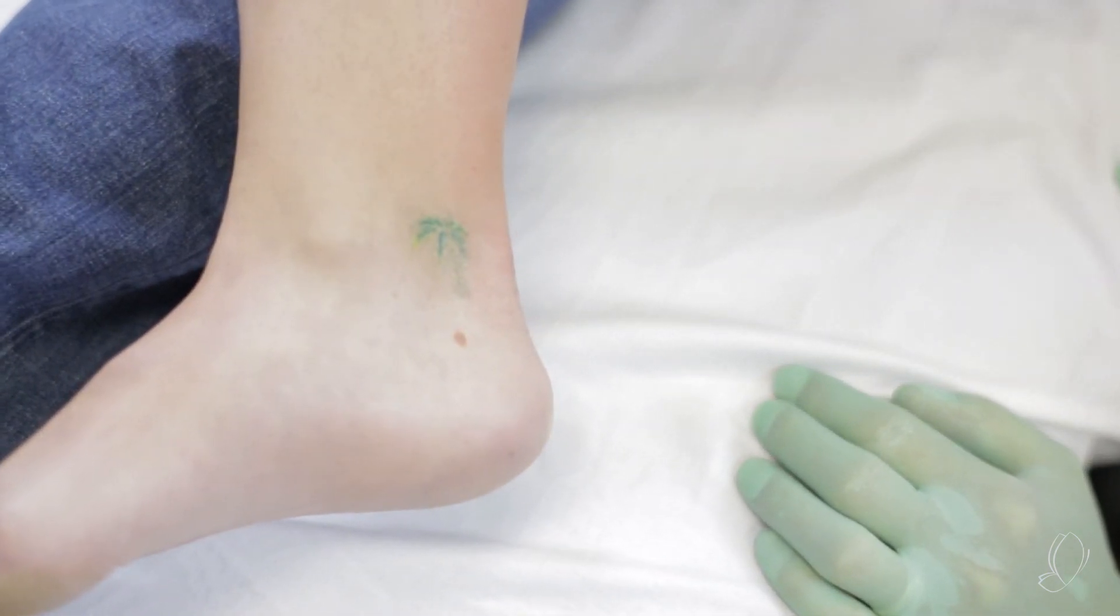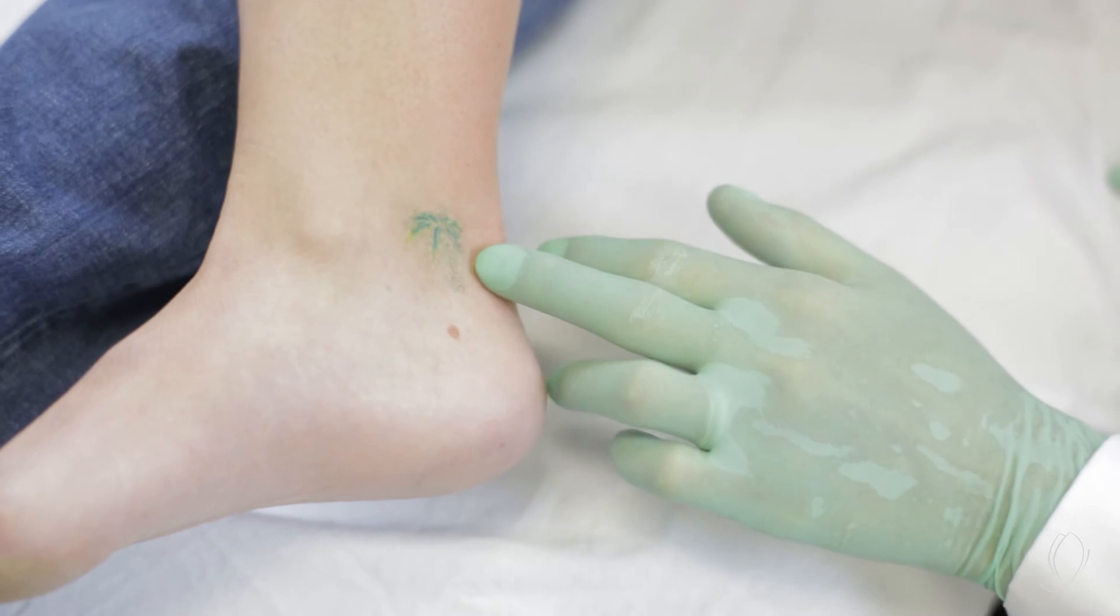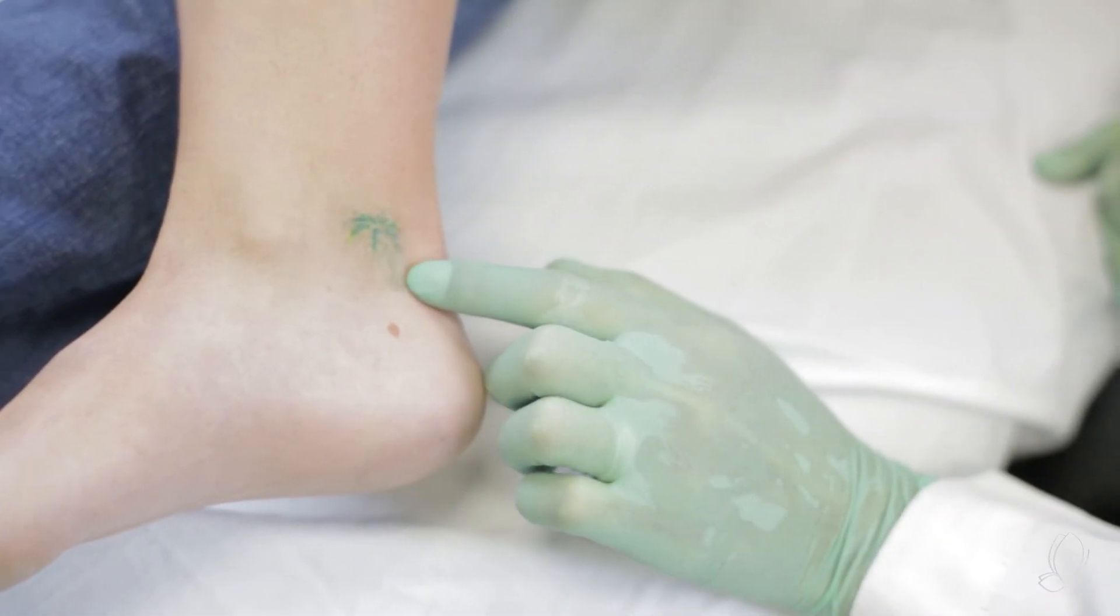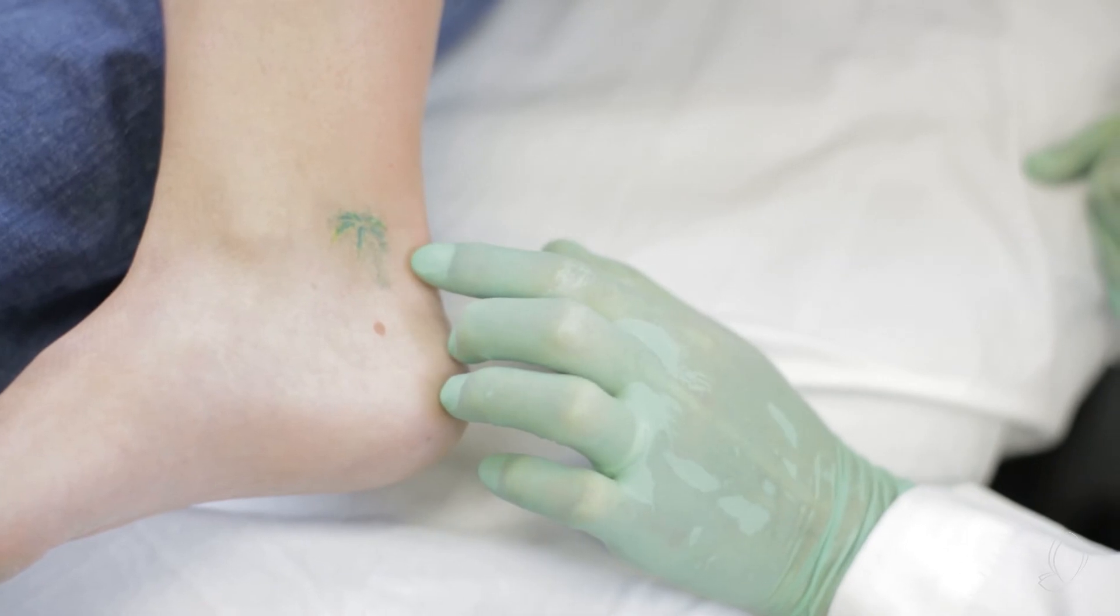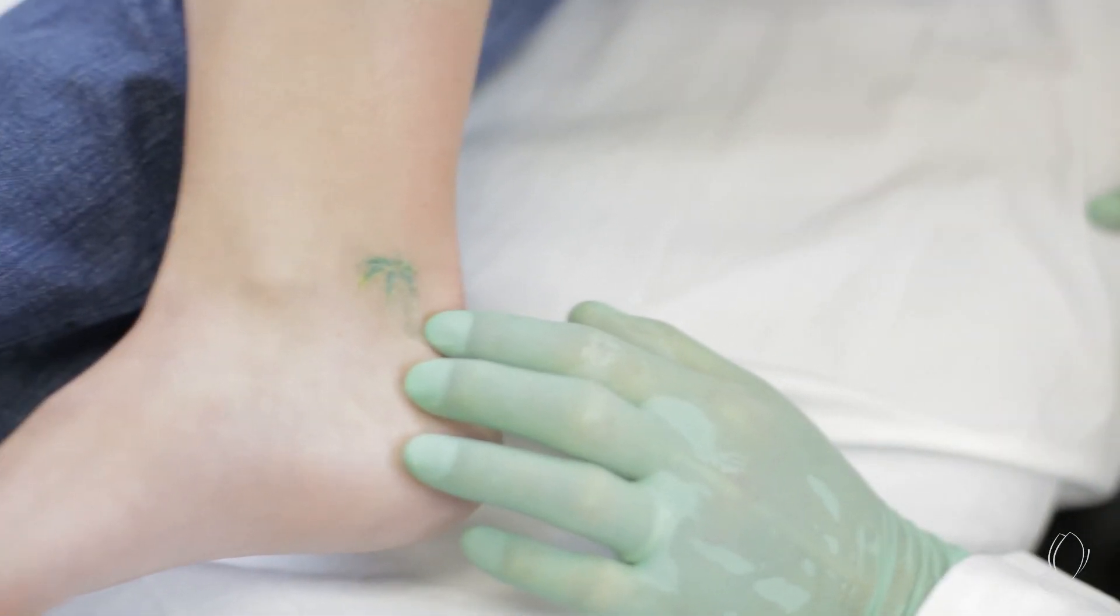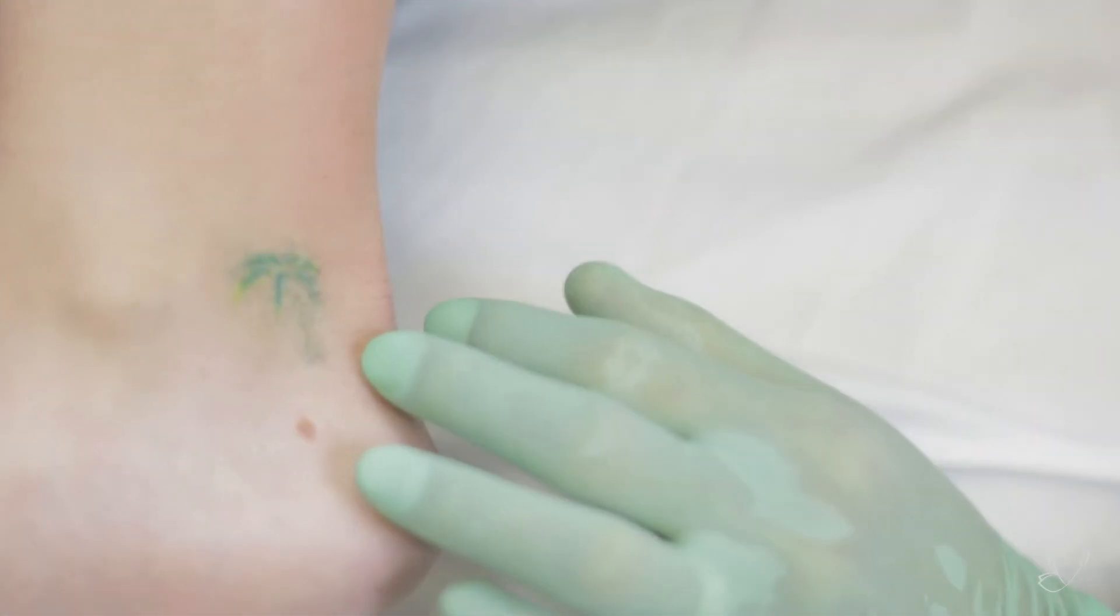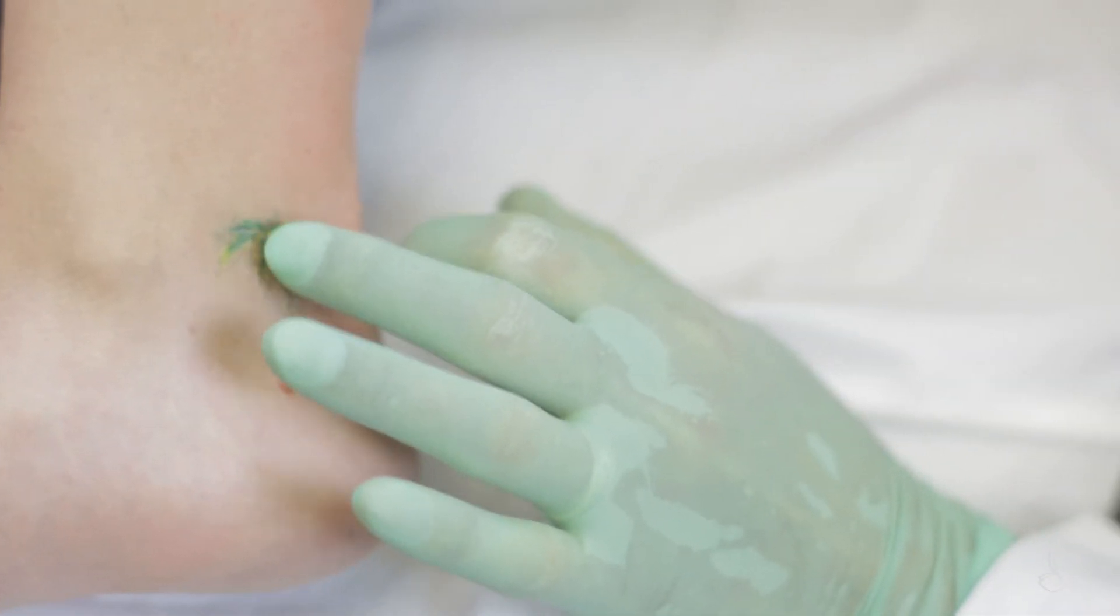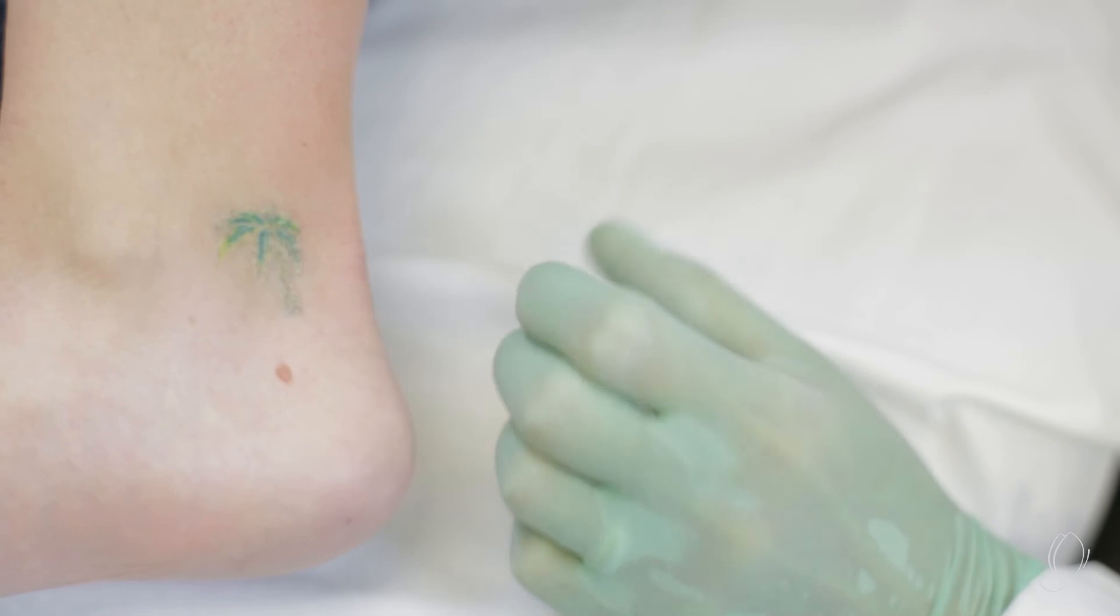How was that? It hurt. It hurt, but I'm good. I mean, the whole treatment was less than a minute, and you can see where we got a good result, where we got great, you could hear the snap, it frosted up, but not too much. And even though we went over this green ink in between, we didn't get much of a reaction.